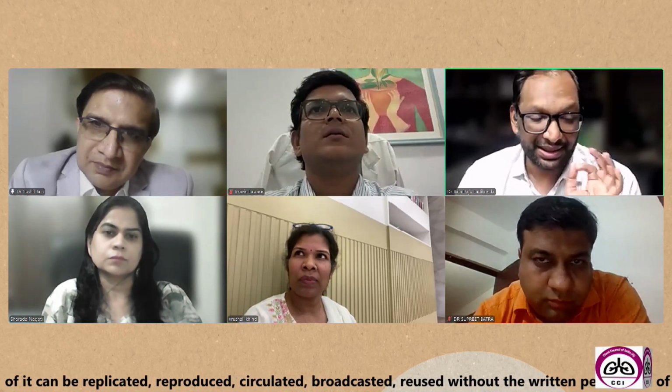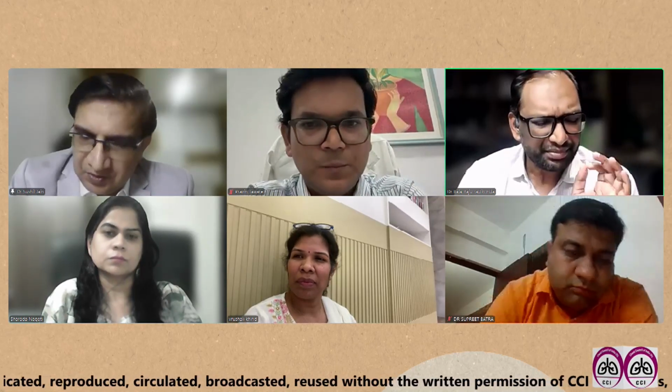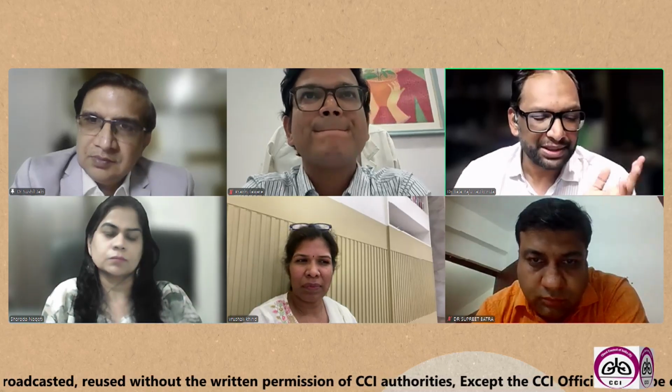In these cases, I use 25. So 25 has better bending capacities than 22. Yes, you can comment on the yield, but my own point is when you don't see the lymph node properly when you're jabbing, you don't have confidence in getting the tissue. So this is point one.